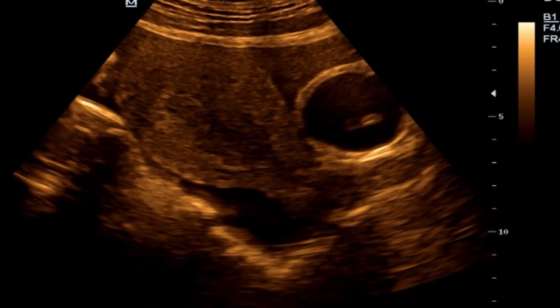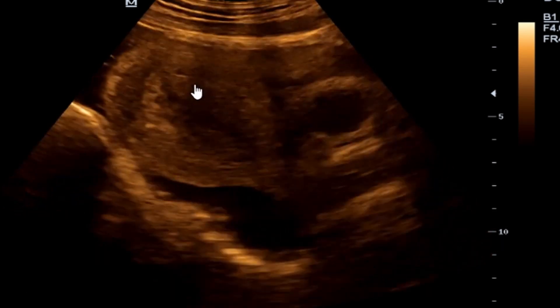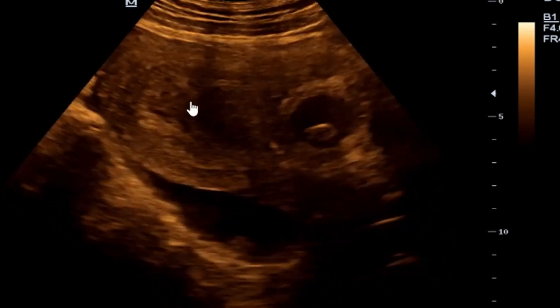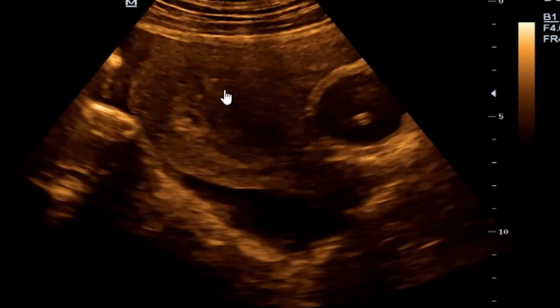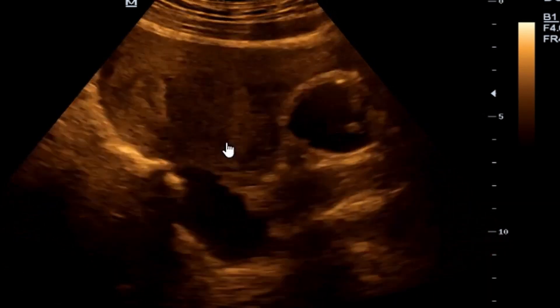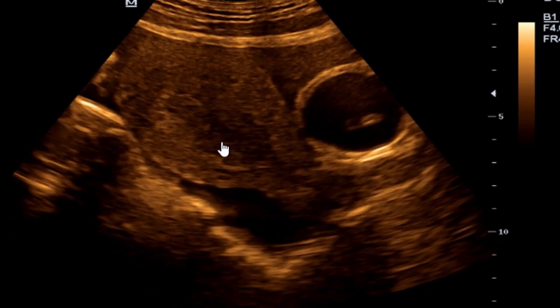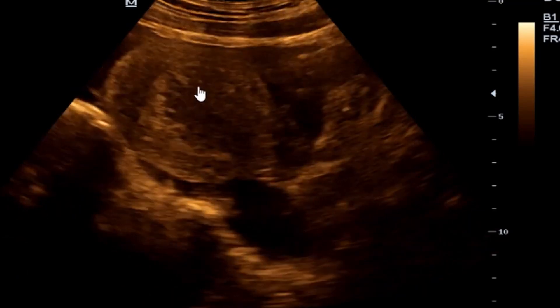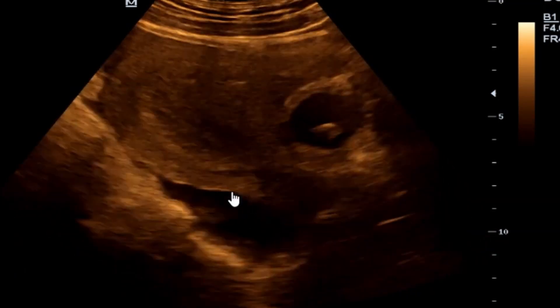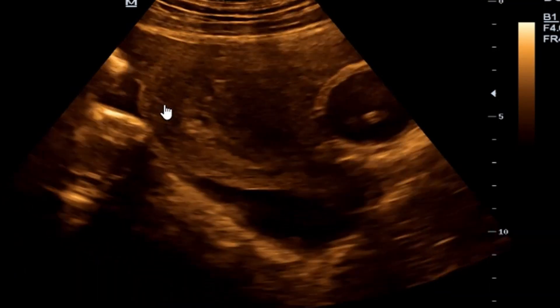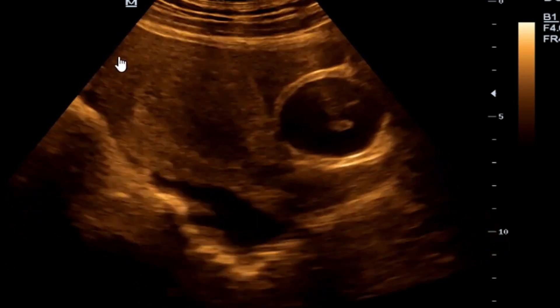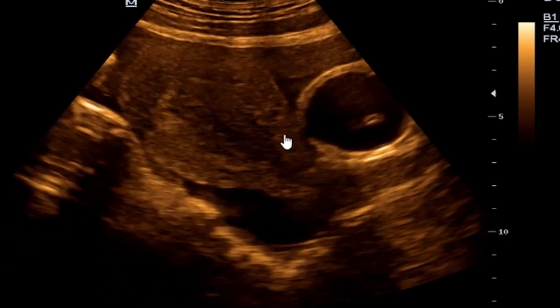This is our endometrium, and in the endometrium you can actually see that we don't see any fetal parts or evidence of pregnancy. This is the endometrium, and then you can see fluid here.